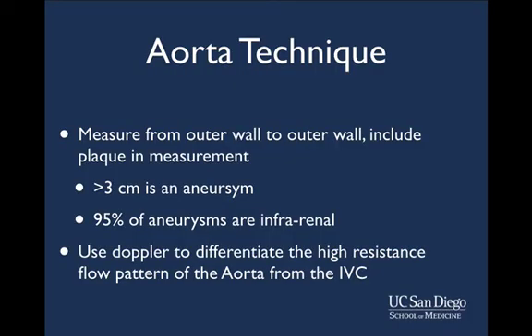When we measure the aorta, it is very important to measure from the outer wall to the outer wall, including all plaque in our measurement. Greater than 3 centimeters is considered an aneurysm. 95% of aneurysms are located infrarenal.